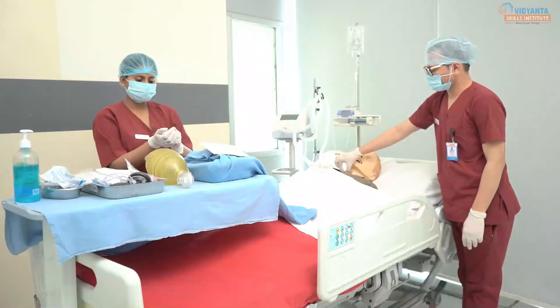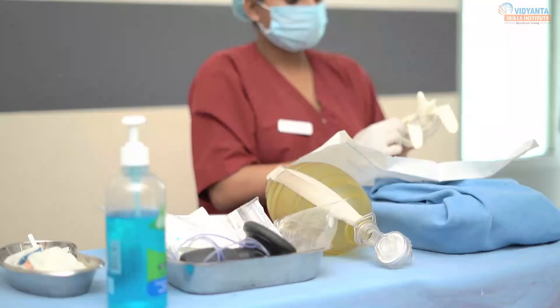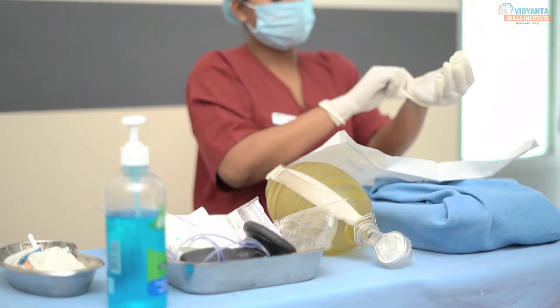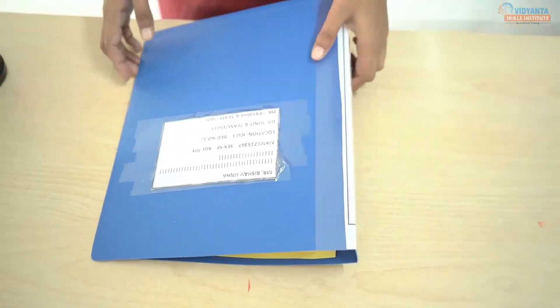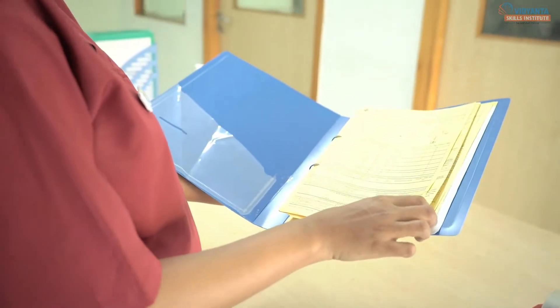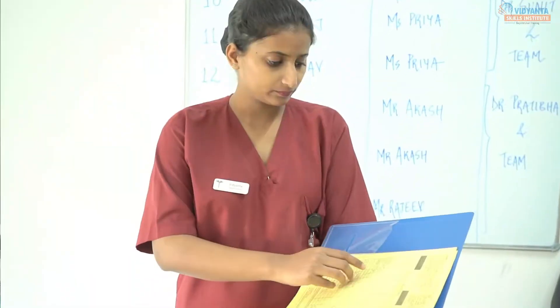Purposes of tracheostomy care: 1. To maintain the airway patency. 2. To prevent infection at the tracheostomy site. 3. To facilitate healing and prevent skin excoriation around the tracheostomy site. 4. To promote comfort. 5. To assess the condition of stoma. Check the ICU flow sheet or doctor progress sheet. Tracheostomy care should be done once a day or whenever it gets soiled.